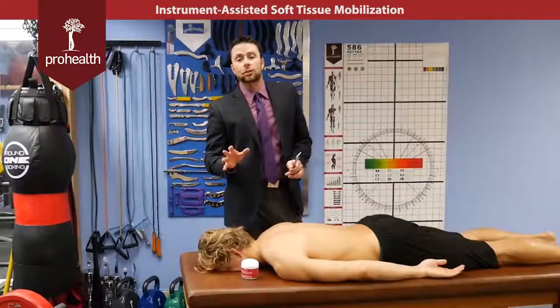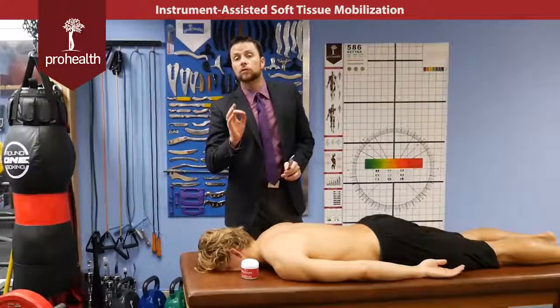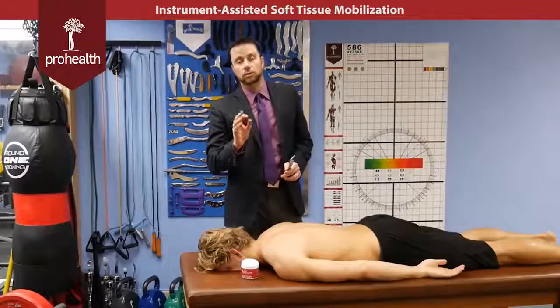When most patients say they want deep treatment, what they actually mean is they want specific treatment. Tissue-specific treatment results in better outcomes.